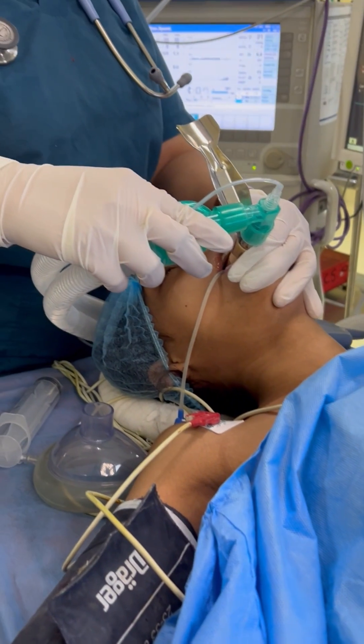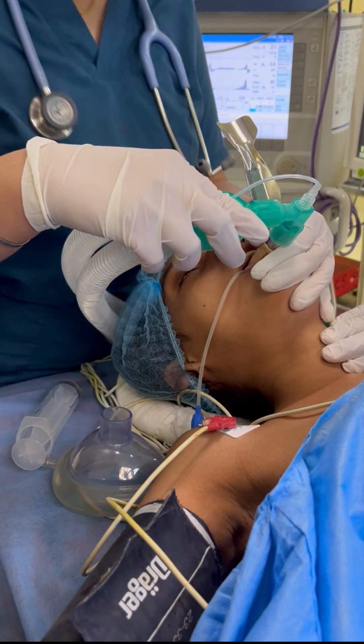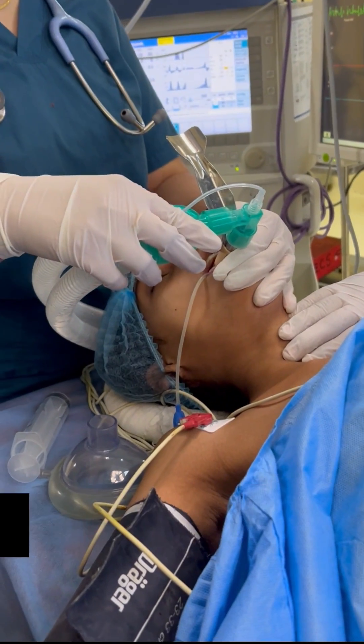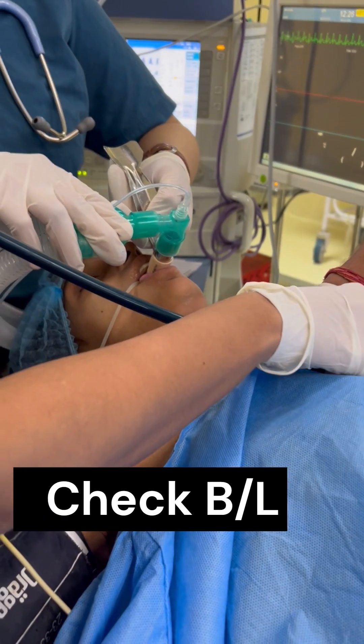Connect the breathing circuit, and check for any leak by manually ventilating the patient, and check bilateral air entry.